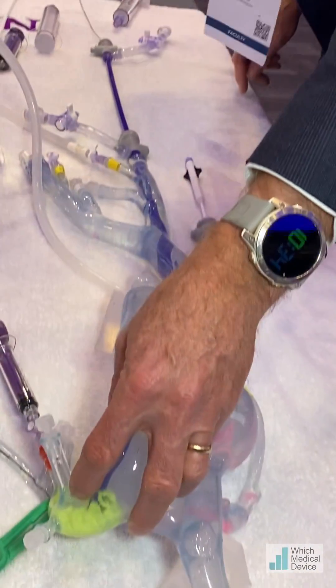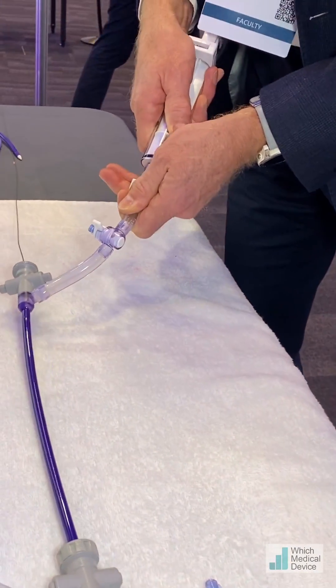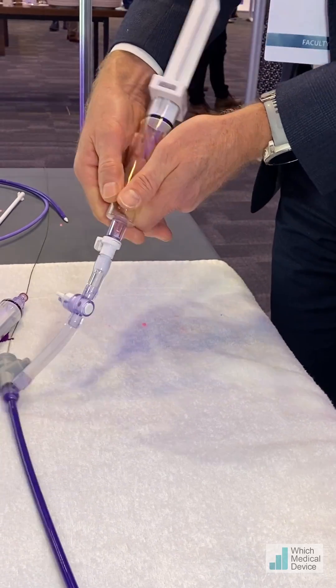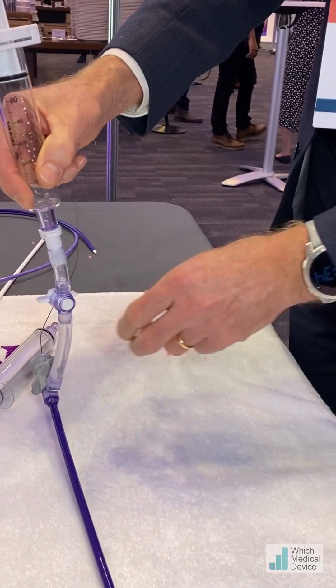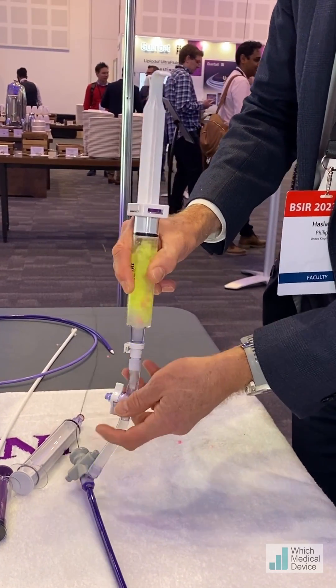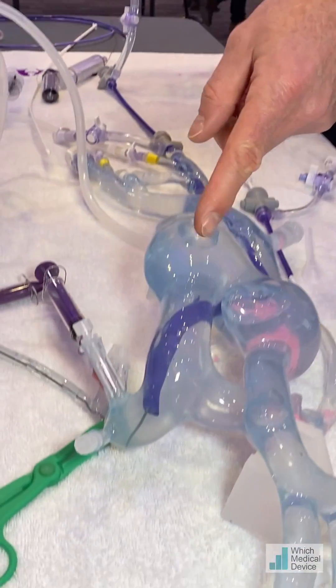So what we're going to do — it's very helpfully in position — we're going to connect our syringe up, click it on here, load the vacuum, hold it up vertically, then open the valve. And there we go — all the clot's gone.